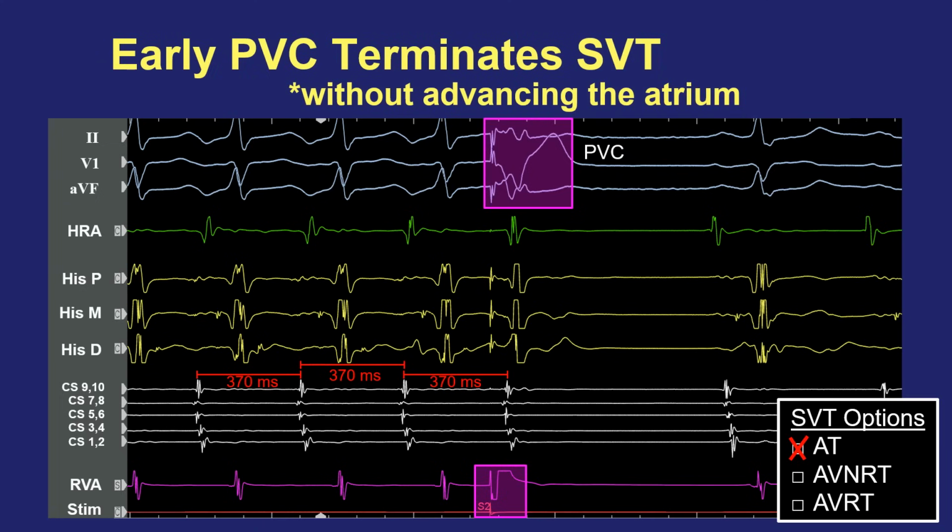It's possible, and certainly if you had been seeing spontaneous terminations, non-sustained SVT, then it could be a coincidence that you happened to put in a PVC when there was also a spontaneous termination that was not caused by your PVC. But if you had a prolonged tachycardia and it just happened to terminate right when you put in the PVC, it was sustained, that's probably not a coincidence. And certainly if you reproduce this and you do it more than once, then it's definitely not a coincidence.